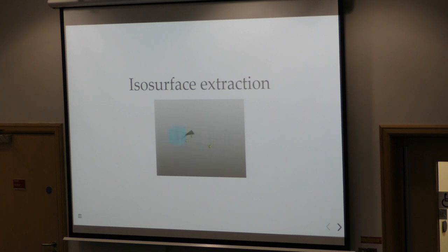So everything we've talked about so far has just been about establishing a clear delineation of these structures, and now we can get on to the actual extraction of a 3D mesh from that. That's isosurface extraction, as the term is referred to, and there are a lot of algorithms that accomplish this. What you see here is a nice animation I found illustrating how a basic marching cubes algorithm works, where it will march through each of the little voxels that make up that 3D space of pixels, and it will insert individual faces where it determines there is an intersection of the inside and outside of a given boundary.